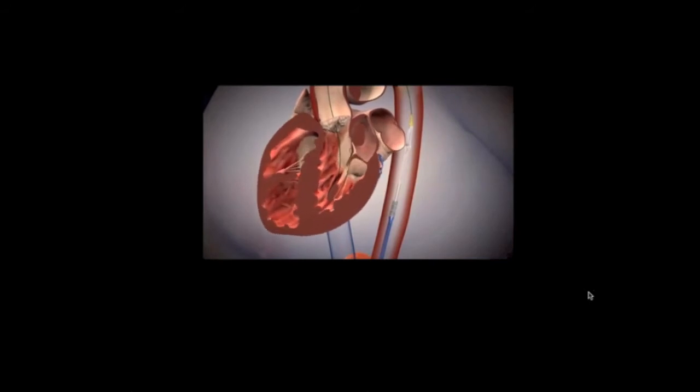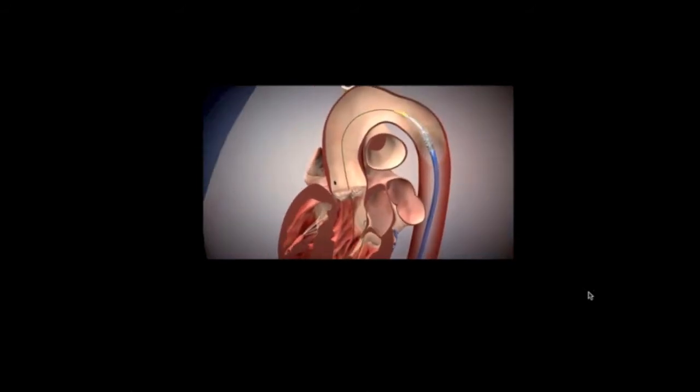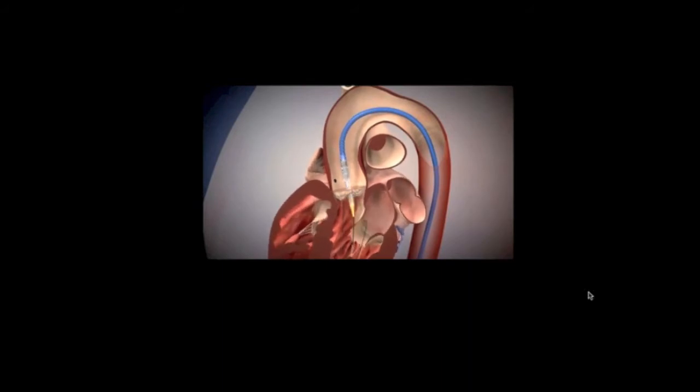What makes it durable is the placement of these valves on the catheter. So this catheter is now being brought up through the distal aorta. The valve is then being mounted on the balloon inside the body in this version of the valve, and this is actually the investigational version. We then place it across the native aortic valve, the whole catheter with the balloon and the stented valve. We inflate the balloon for a period of about 5 seconds, and then this valve immediately becomes the functioning valve within the heart.